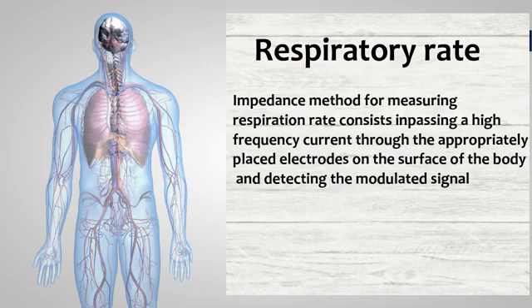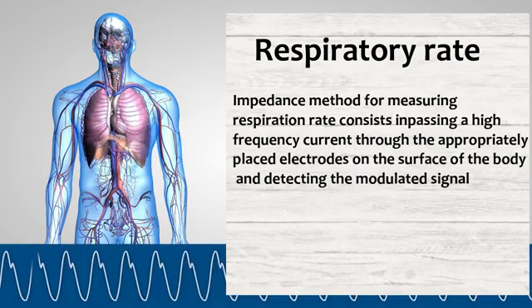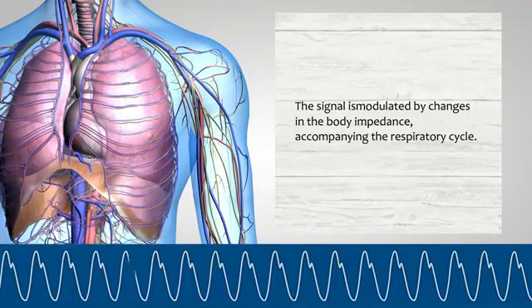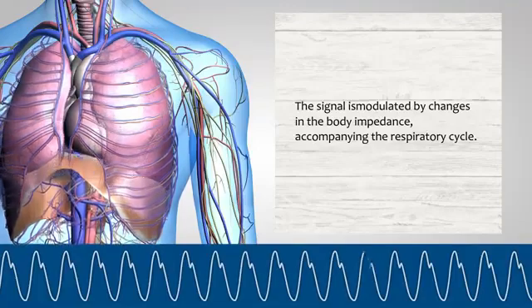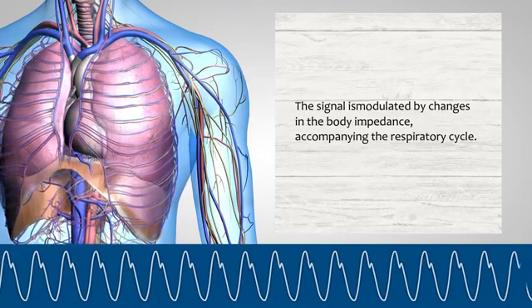The next measurement related to ECG leads is respiration rate. This is an indirect technique for the measurement of respiration rate. Using externally applied electrodes on the thorax, the impedance pneumograph measures rate through the relationship between respiratory depth and thoracic impedance change. The technique avoids encumbering the subject with masks, tubes, flow meters or spirometers, does not impede respiration, and has minimal effect on the psychological state of the subject.